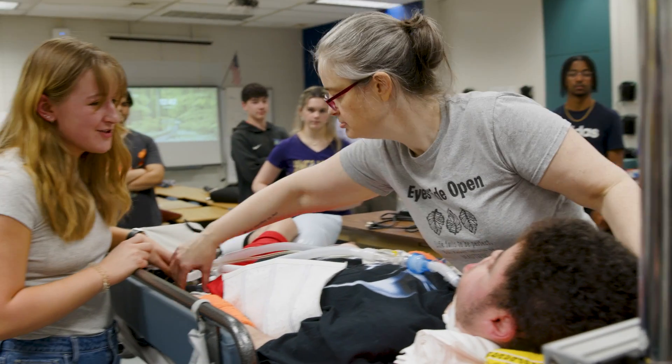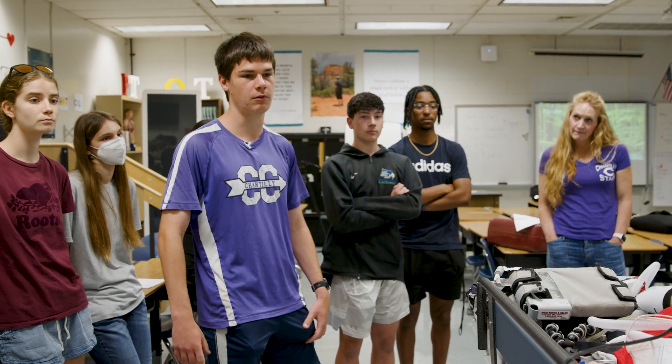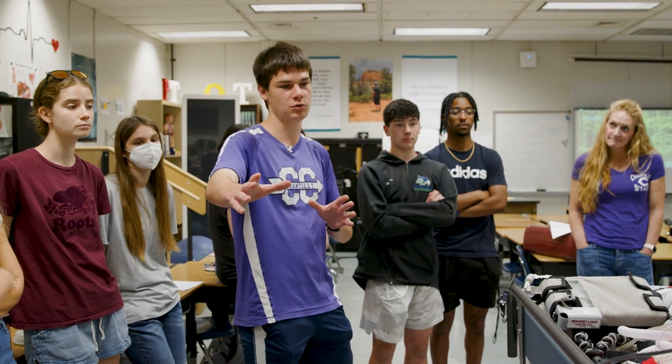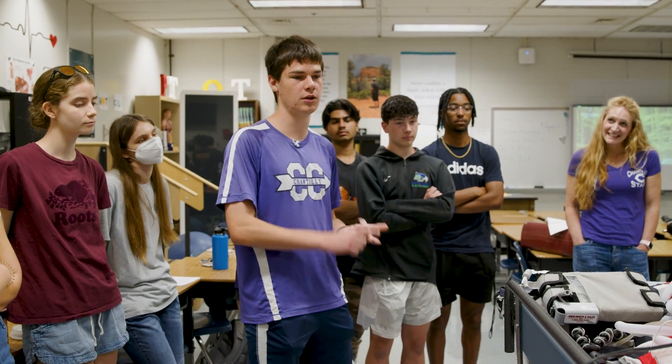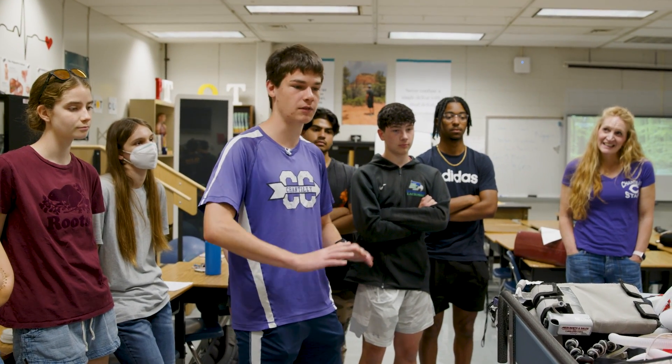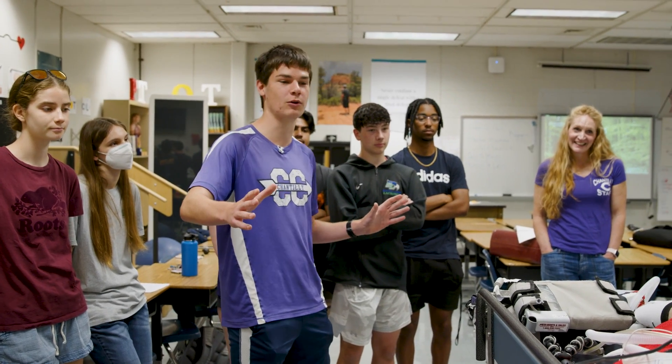I saw your Star Wars hat — it's pretty cool! Right now we've mostly finished with the structural stuff, so we're going to make it look a little bit cooler. We're 3D printing and we're going to get some decals of Star Wars and Marvel and all that stuff so it looks a lot more cool.